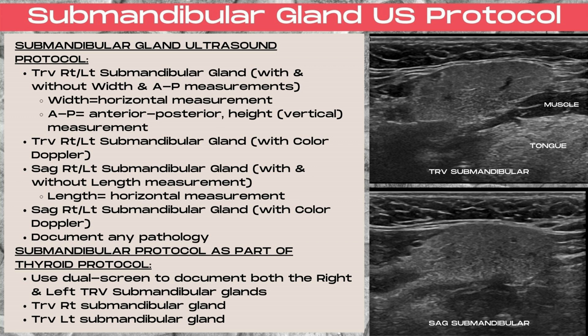When imaged separately, you want to take a picture of the transverse right or left submandibular gland with and without width and AP measurements. Note that width is going to be a horizontal measurement, and the AP measurement is going to be a vertical measurement on ultrasound. You also want transverse right and left submandibular gland images with color Doppler.